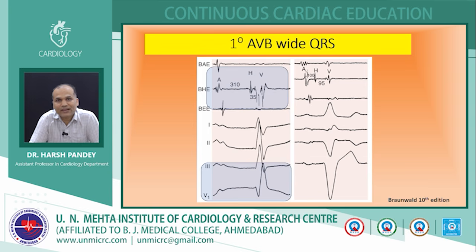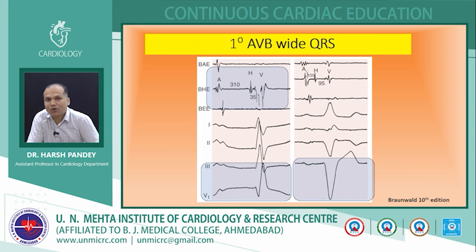block. On the right side, you can see the patient having left bundle branch block, prolonged PR interval, and the HV was prolonged, more than 55 millisecond. Now here it is 95 millisecond.